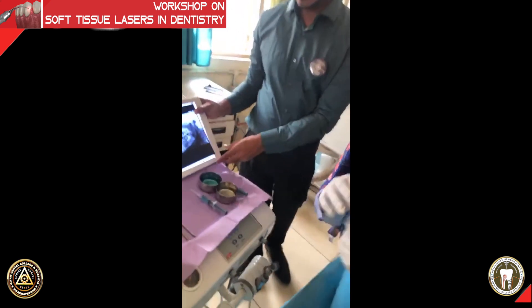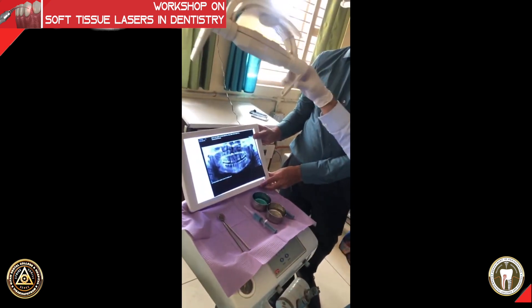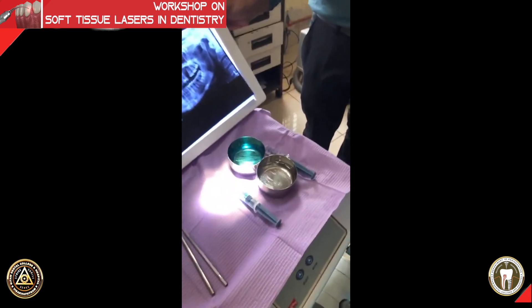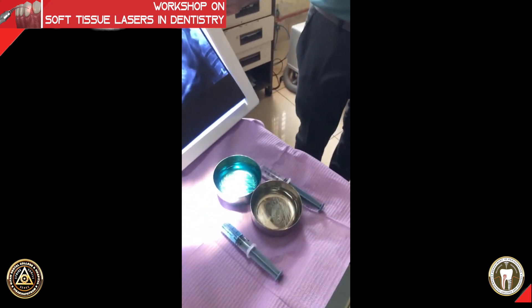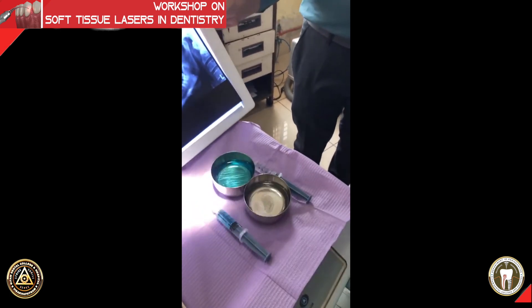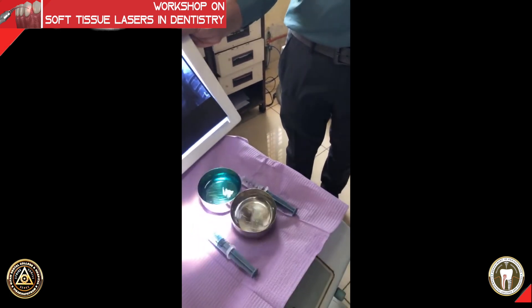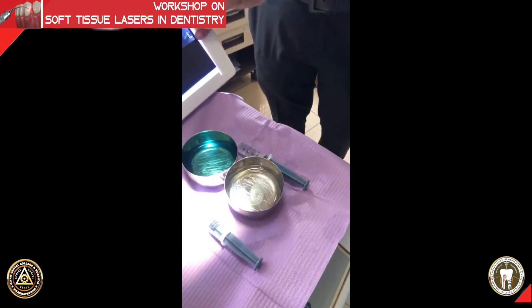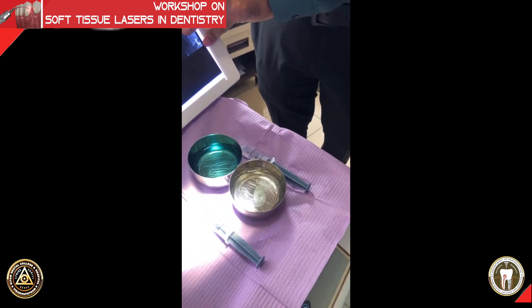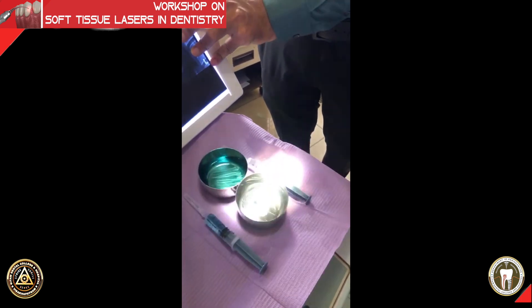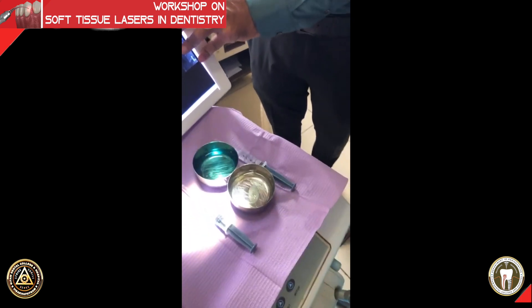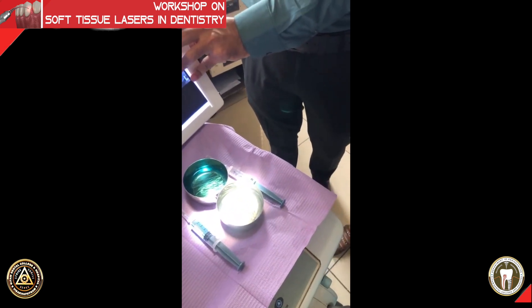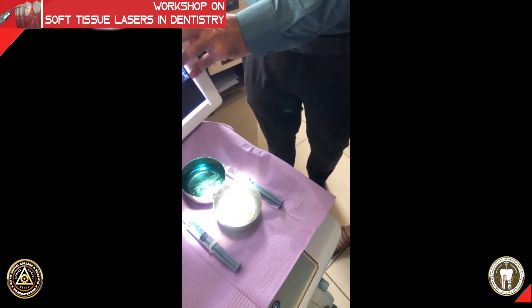The photosensitizer dye has been prepared. This is a methylene blue dye, and the concentration prepared is 0.05%. You can use 0.1% or 0.05% — as per the literature, either of these two concentrations can be used for photodynamic therapy.